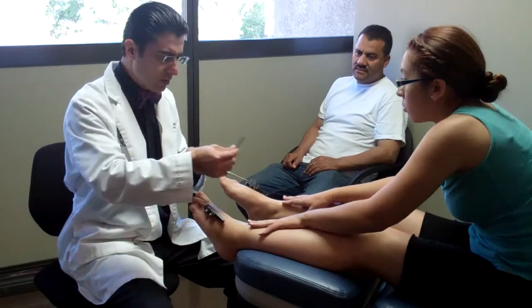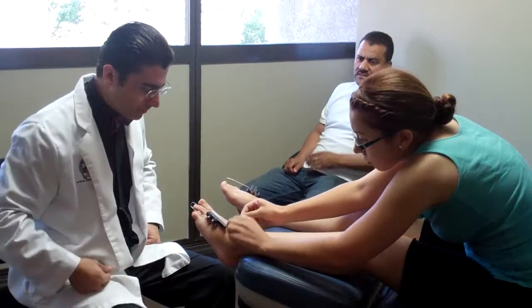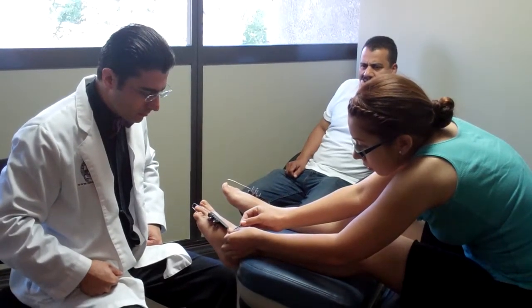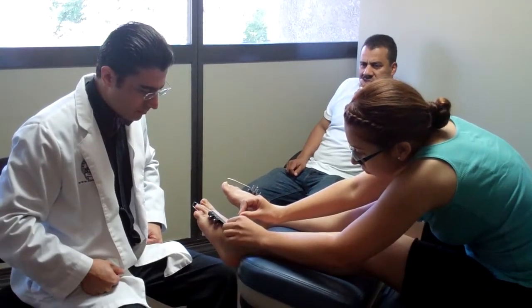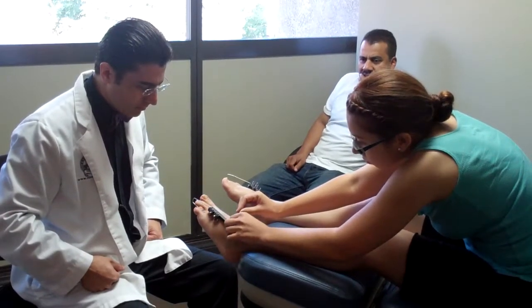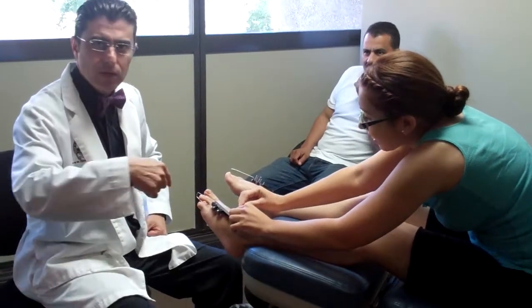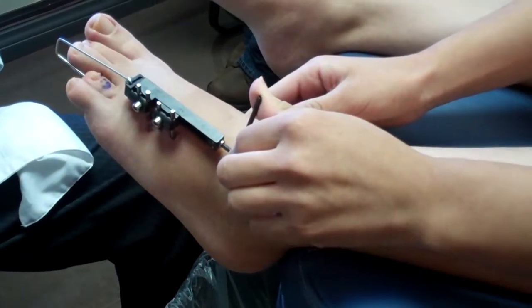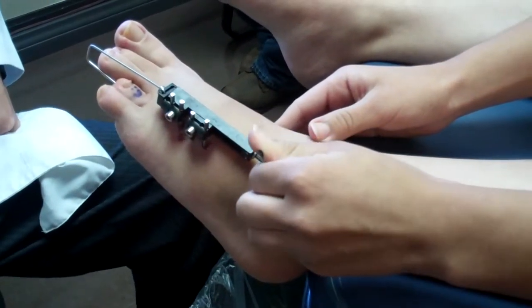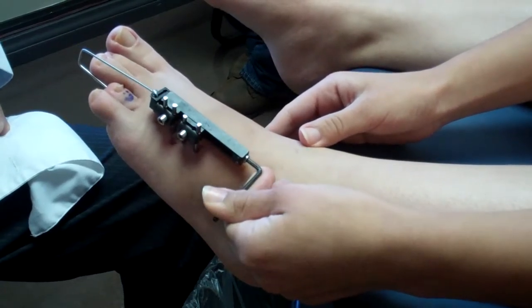So I'll let you do one more turn. I would put it that way. Do you feel it? Yeah. And stop it.